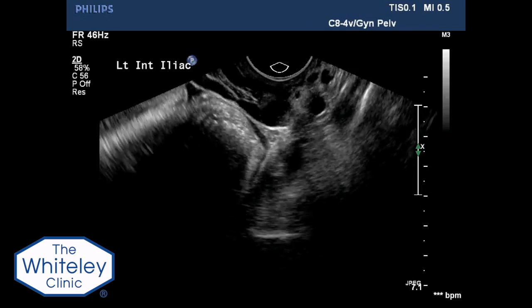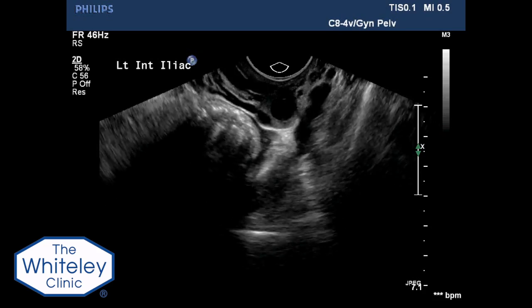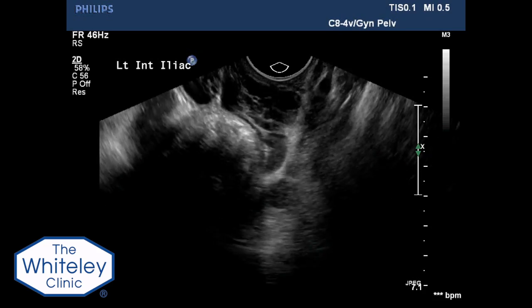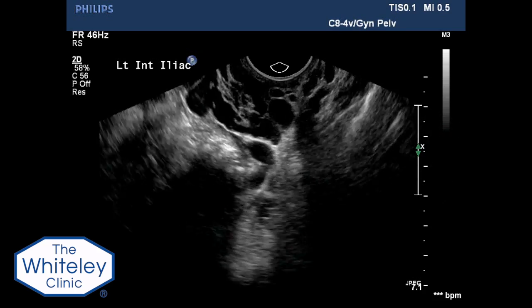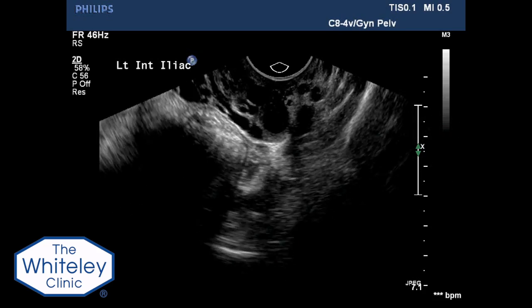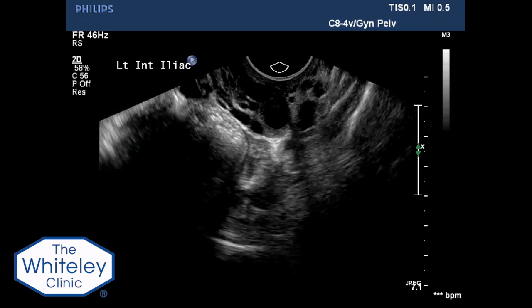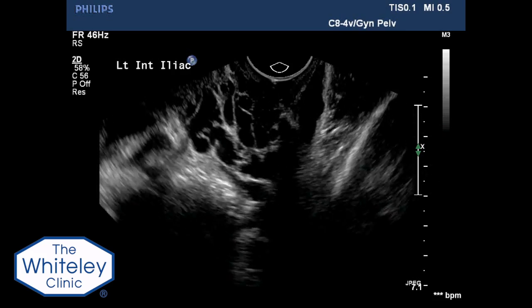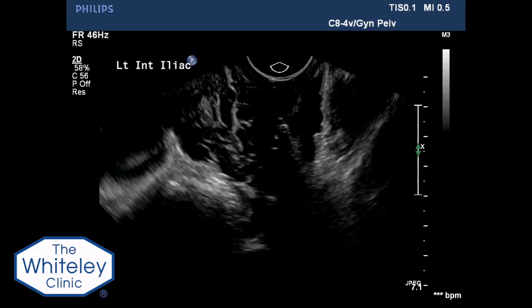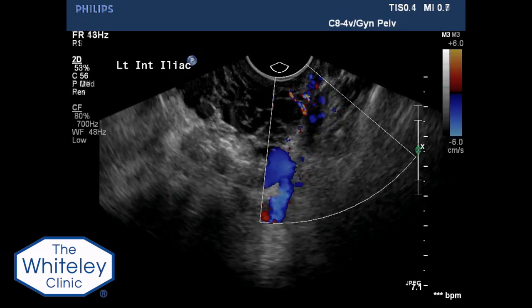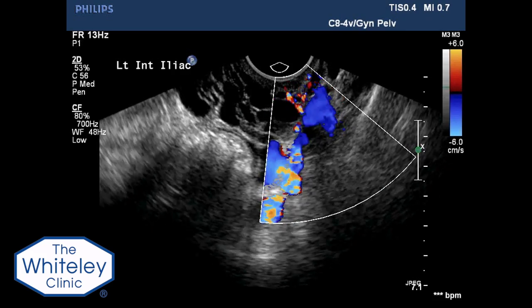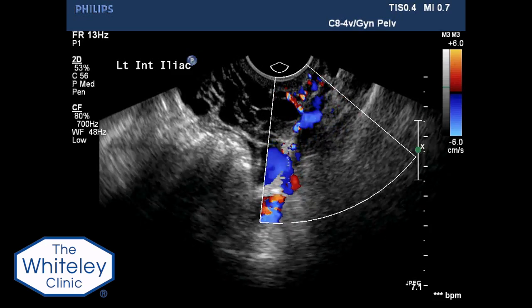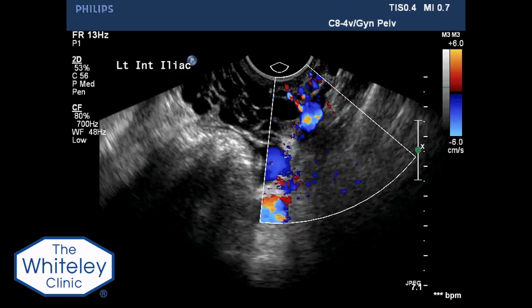The transducer can be seen here following the path of the internal iliac vein, with a small portion of the ovarian vein seen medial to it. Colour flow Doppler and Valsalva are used to assess reflux.